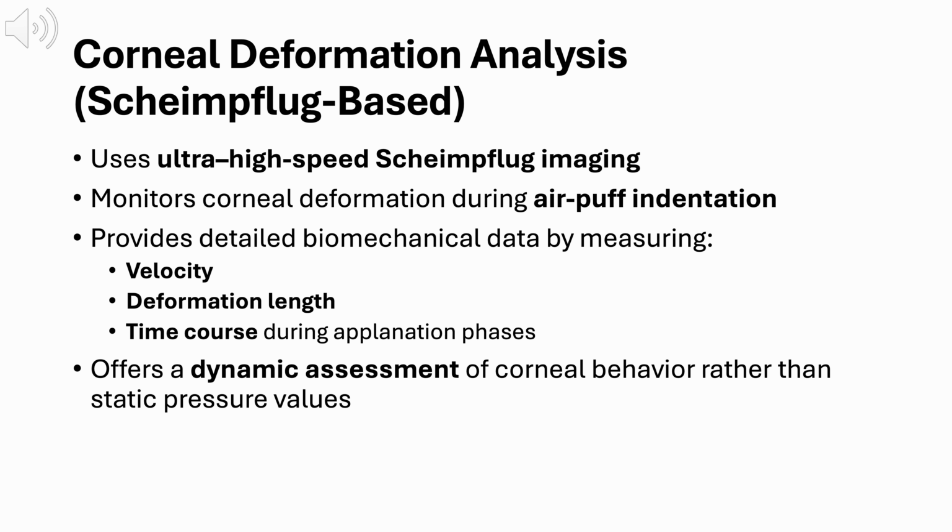This slide moves beyond pressure numbers and focuses on how the cornea actually moves in real time. Scheimpflug-based deformation analysis uses ultra-high-speed Scheimpflug imaging to capture the cornea during an air puff indentation. Instead of just recording when the cornea flattens, the system continuously monitors how the cornea bends inward and then recovers. From that motion, it can measure several dynamic properties, including how fast the cornea moves, how much it deforms, and the exact timing of each phase of applanation. These parameters give much more detailed biomechanical information than a single pressure value.